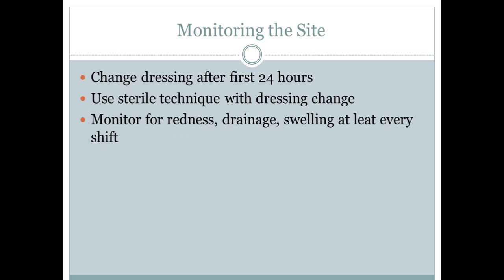I also want to mention here really quick that generally your facilities might have dressing changes every 72 hours or every week. That's also going to go with the flushing too, depending on how much it is being accessed. We are going to be flushing before and after antibiotics if it's intermittent therapy. So those are things you're going to be keeping in mind. Obviously, your central line is not going to require as much flushing care as your peripheral IV site.